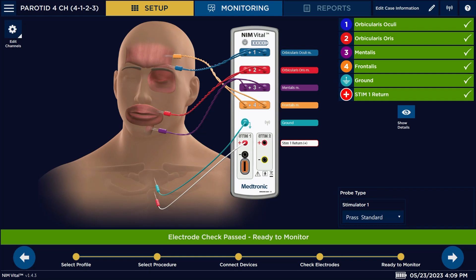You might ask why there was a 4-1-2-3 and a 1-2-3-4 — it's just the positioning of the electrodes. For the 4-1-2-3 option, number one (blue) is your eye, number two is your lips, number three is your chin, and number four is your forehead. If we would have picked the other one, number one would have been your forehead, number two your eye, number three your lip, and number four your chin.